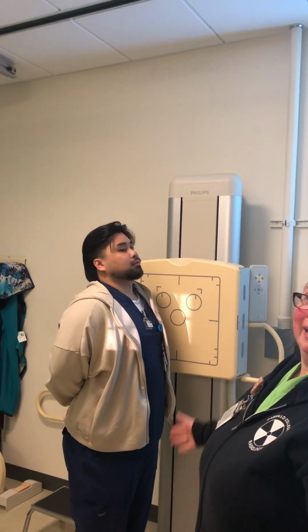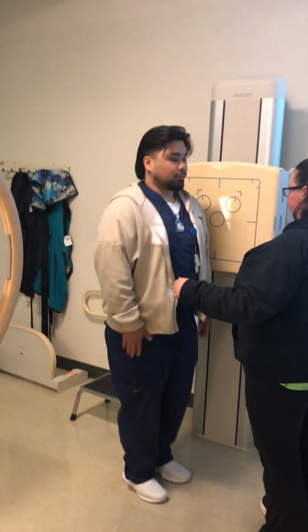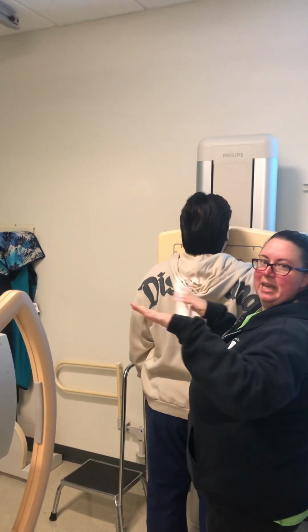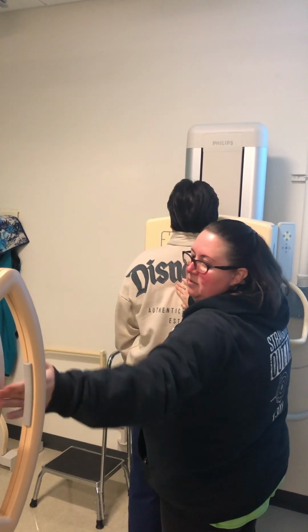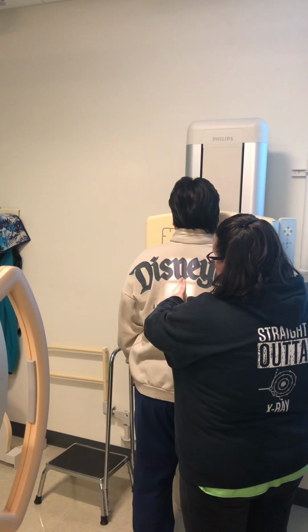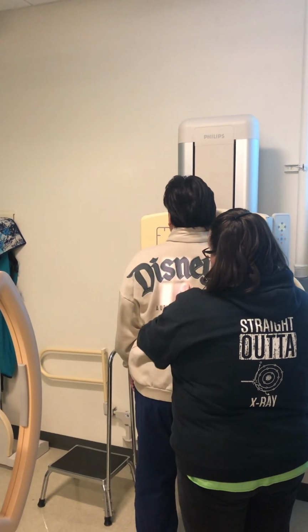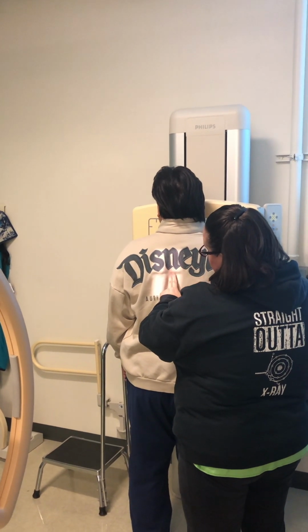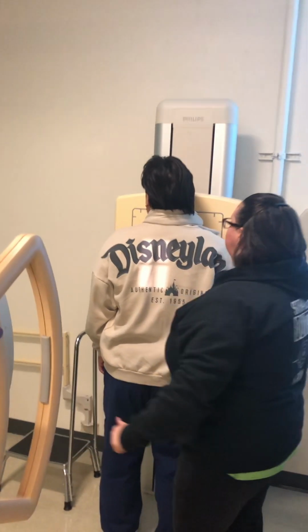Okay, so that's my lateral. Now, to do the RAO, go ahead and face the board for me. Like I said, I don't necessarily have to change my height, because that should be the same. But I'm going to center initially, and then make my adjustment to 15 degrees, okay? And what that should do is shift the centering about an inch off of the spine. I'm just looking from this side here.